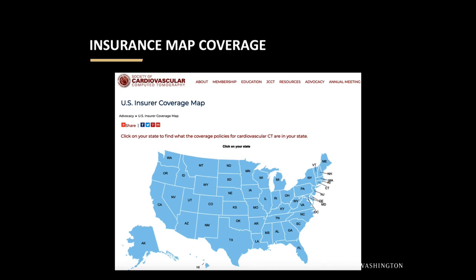I mean, do we really need to have a CT scan with radiation and cost to make this decision about treating medical therapy? Is there a better non-invasive score that we can use to do that? I'm not aware of anything that can do it better. I think this is the one trial that has shown that this is maybe an expensive but effective way to get patients on better medical therapy.